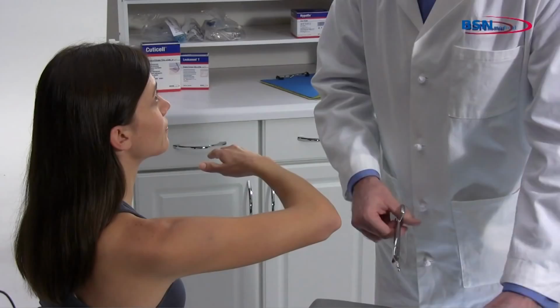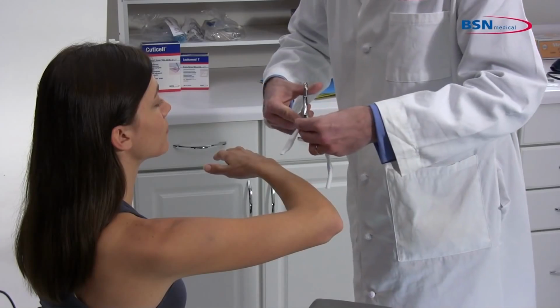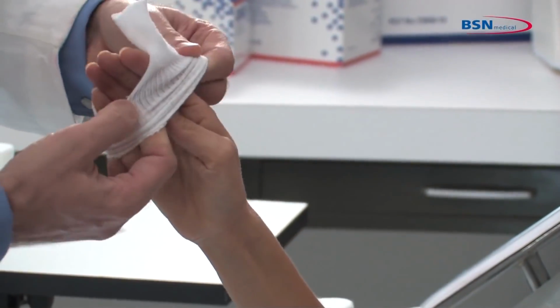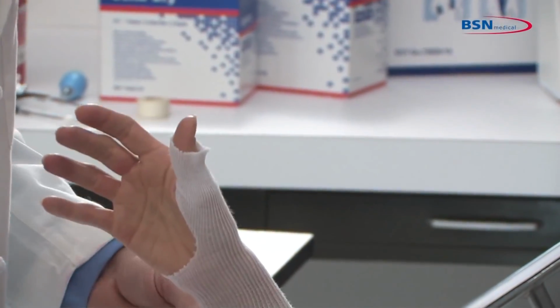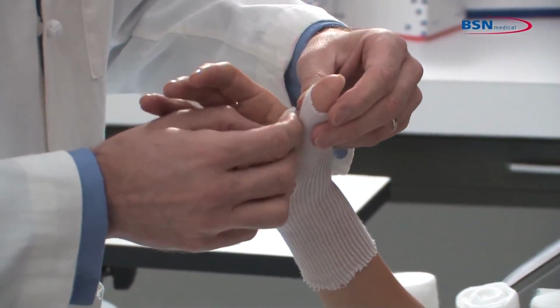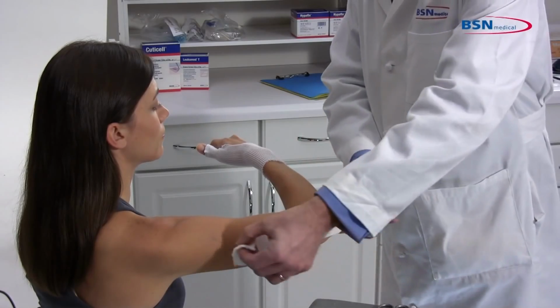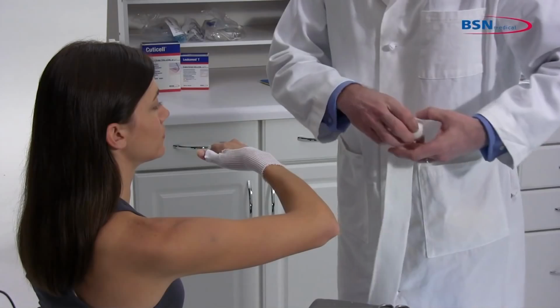Cut a 6-inch length of 1-inch stockinette. Cut halfway across the stockinette, about 1/3 down the length. Then, slide stockinette over the wrist and apply cut section over the thumb for protection. Another option is to measure the length to the thumb and make a cut at that length to slide over the thumb.